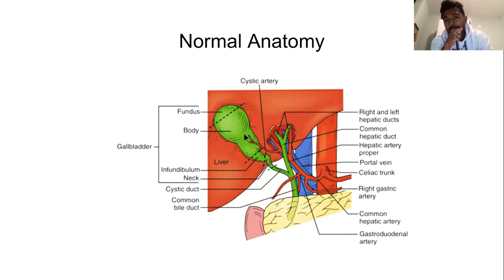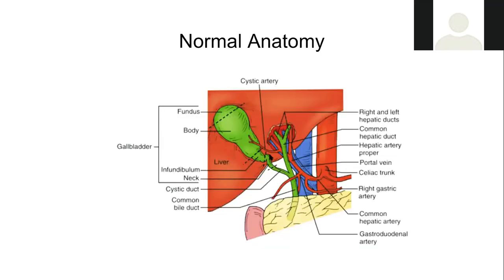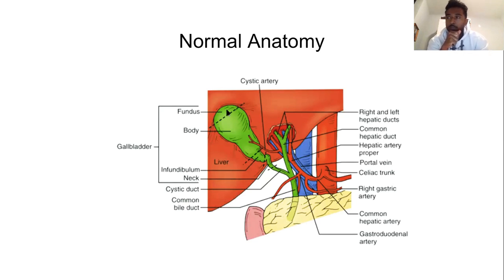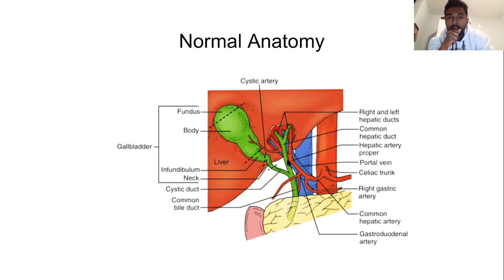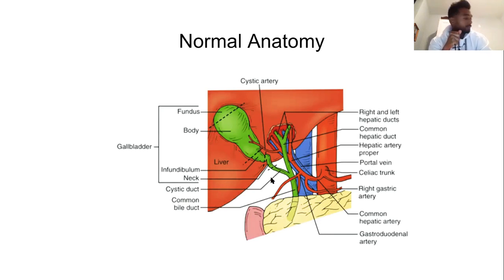This is kind of not normal, because how the gallbladder normally looks is like one of those sunflowers that hasn't gotten a lot of sun. It looks stooped, looks sad. But in this one, it looks all tall. I think they use the probe to lift the structures, and that's what they're doing here. You can even see a bend. It's supposed to hang down like this. Other than that, just know the normal structure. You have the portal triad, and then the inferior vena cava. These are the normal things usually in that area. Just remember that.